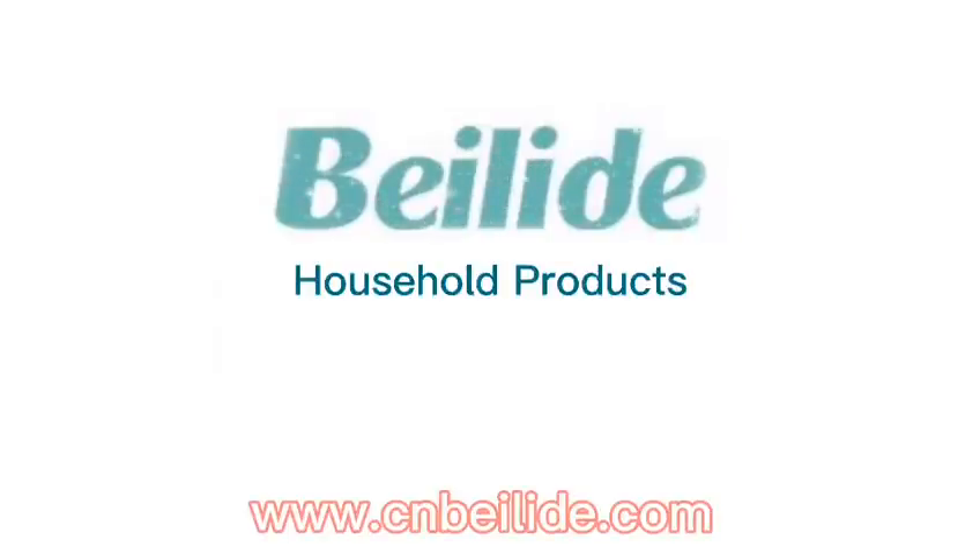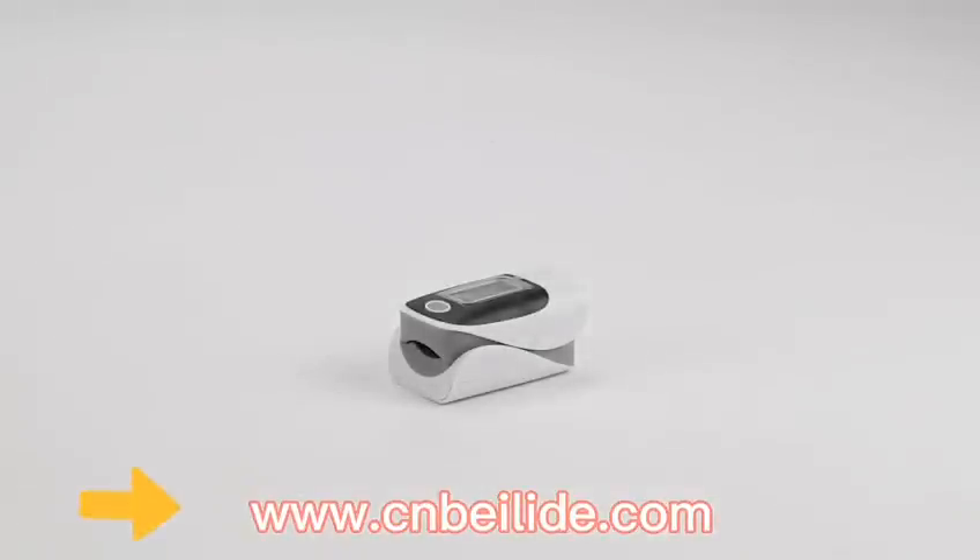Pulse Oximeter by Bailey. This household product is used to measure oxygen saturation in the blood. Welcome to visit our website for more information.